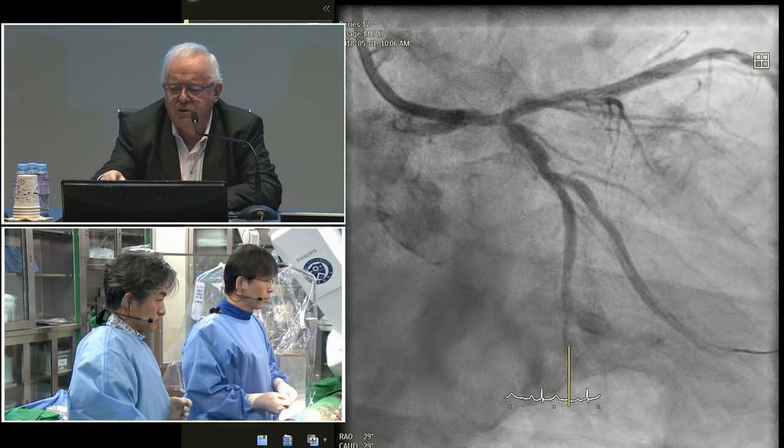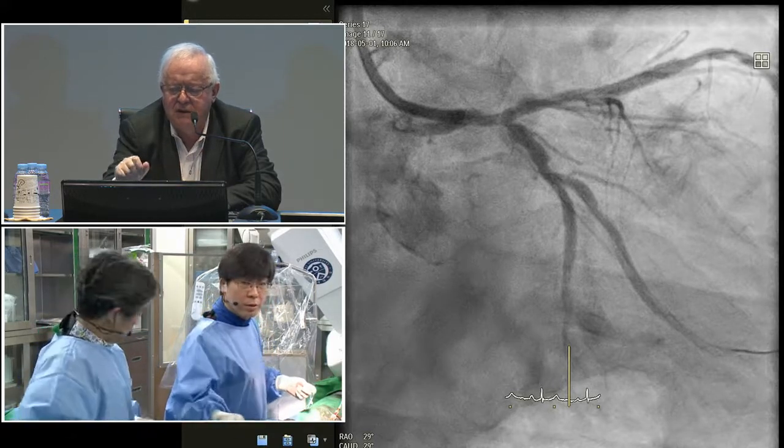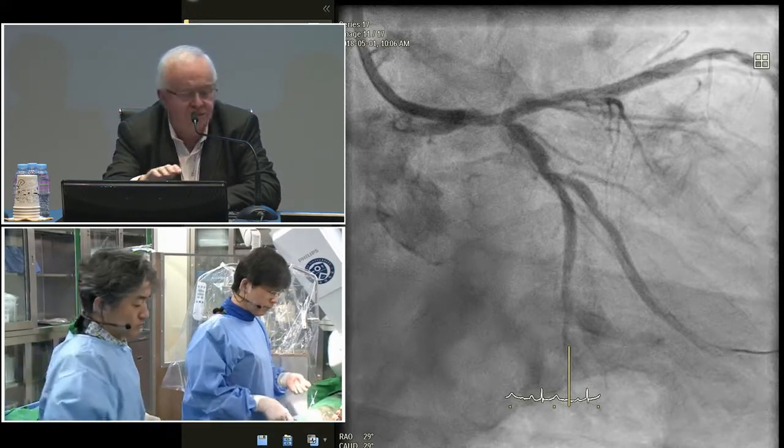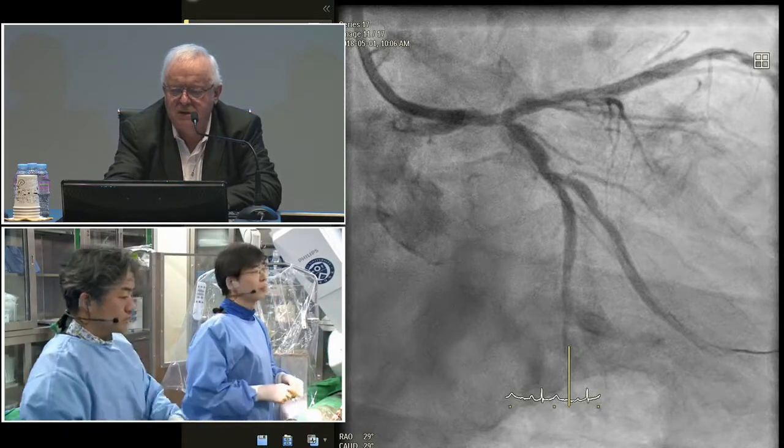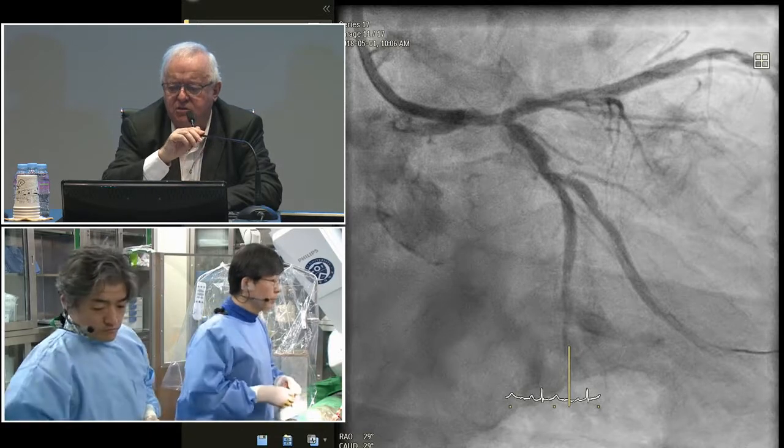So another option will be to stent the lesion that has been pre-dilated, but not close to the ostium, leaving some space there. Then do a crossover stenting, using the diameter of the LAD, going back to the ostium of the left main, because this is diffuse disease, and do a POT. After that, do a kiss, and judge the result if it's necessary to put another stent at the ostium.